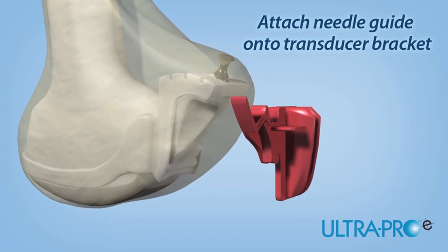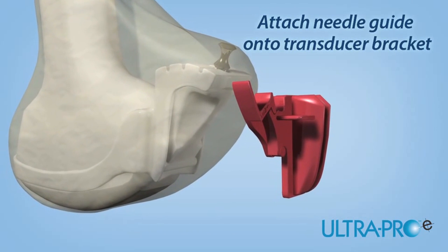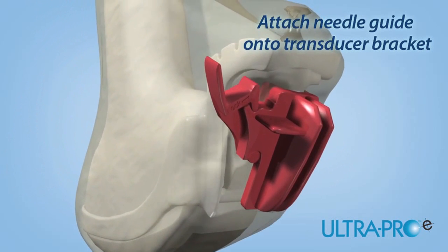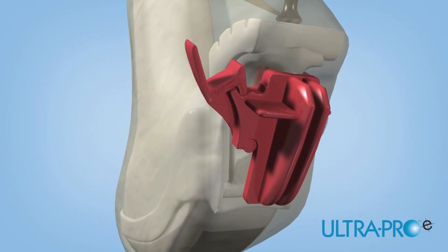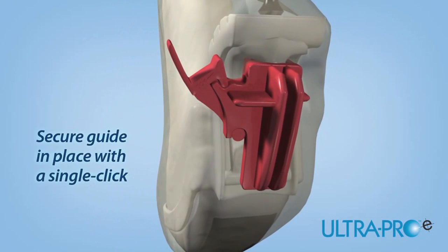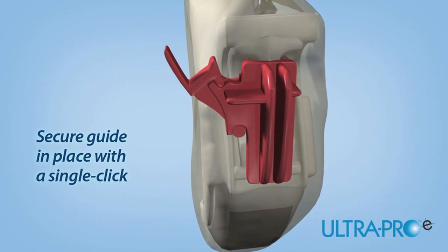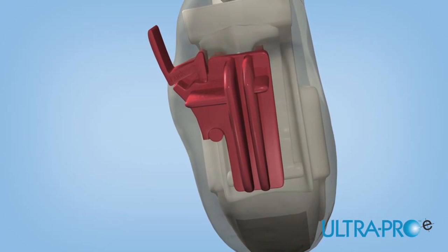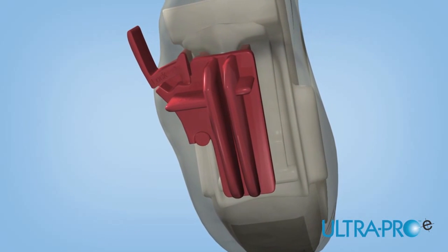Slide the disposable UltraPro E needle guide onto the transducer bracket. The UltraPro E needle guide features a robust lock for secure attachment to the bracket. Using your thumb, lock the UltraPro E needle guide into place by pressing the locking mechanism inward. Once the guide is secured, the UltraPro E needle guidance system is ready for use.